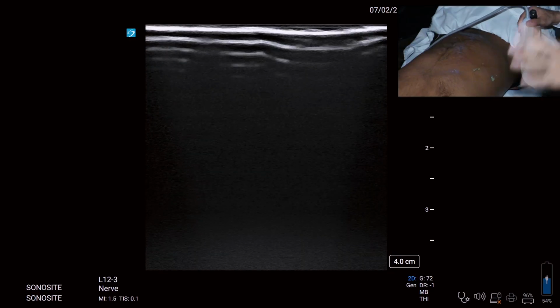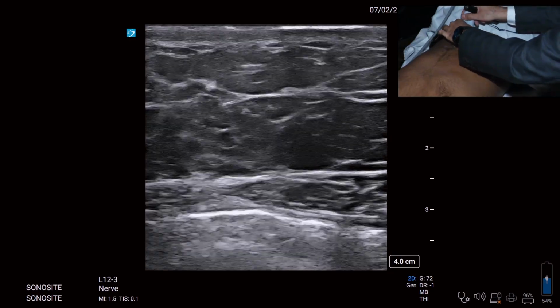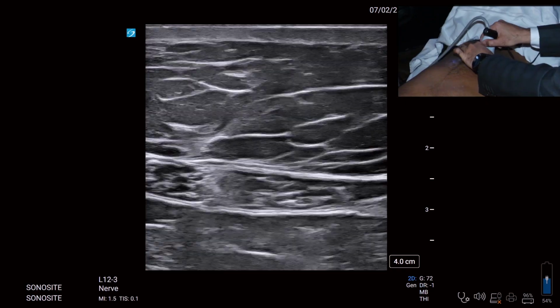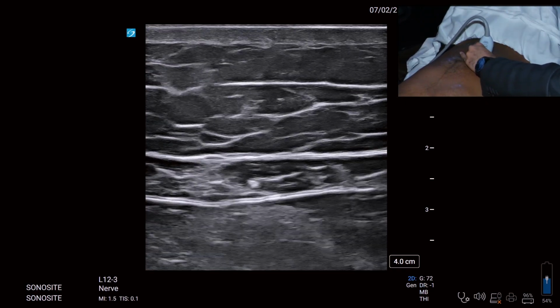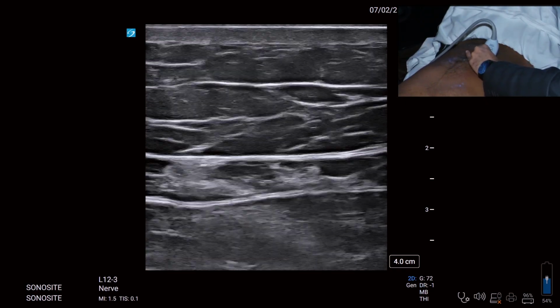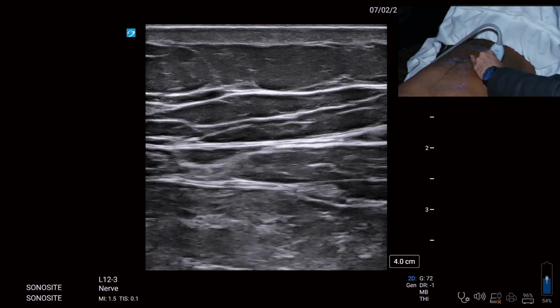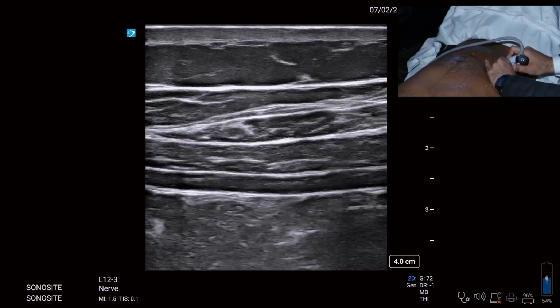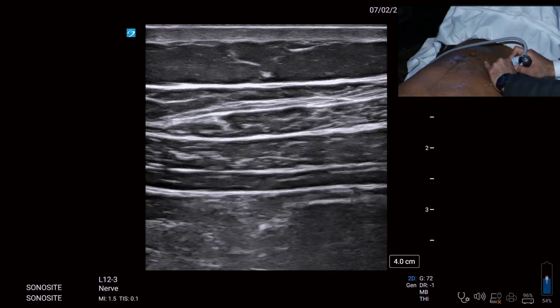Very nice. So now coming on to the mid-axillary tap. Let's start from close to the umbilicus. Can you see the umbilical shadow? Can you see the rectus abdominis? Twin track appearance. I keep moving laterally. I encounter the linea semilunaris. Then three muscles: external, internal, transversus. Beautifully seen?